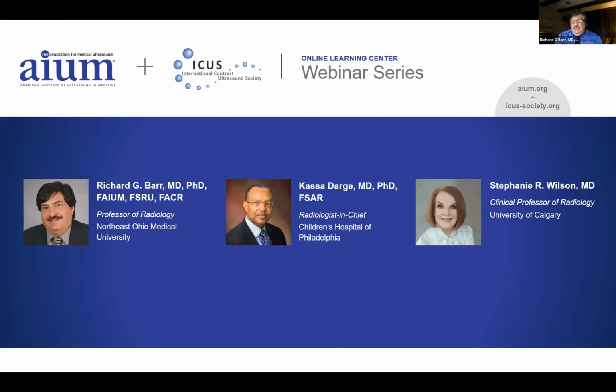I would just like to add that a lot of the POCUS ultrasound machines are not as advanced as the ones we are using. Although they may have contrast, they may not be as accurate as our systems are. So I think it's really important, if you are going to do this in the ER, that you have a high-end system that can evaluate the patient appropriately. A lot of the smaller systems may have contrast, but their ability to see the bubbles is decreased. And in a lot of these cases, we're looking for very small areas of enhancement that could easily be missed with that inferior equipment.